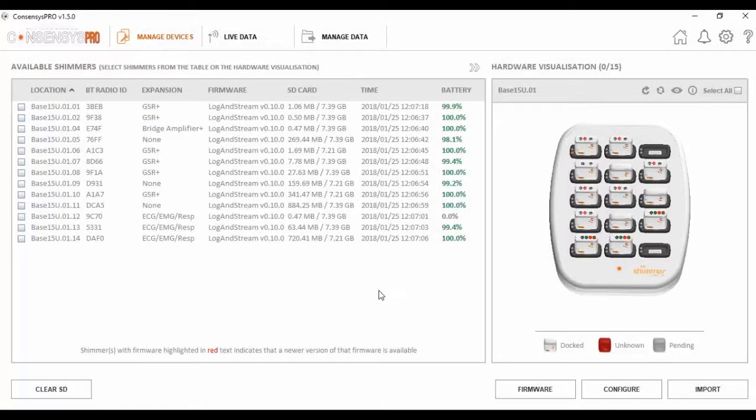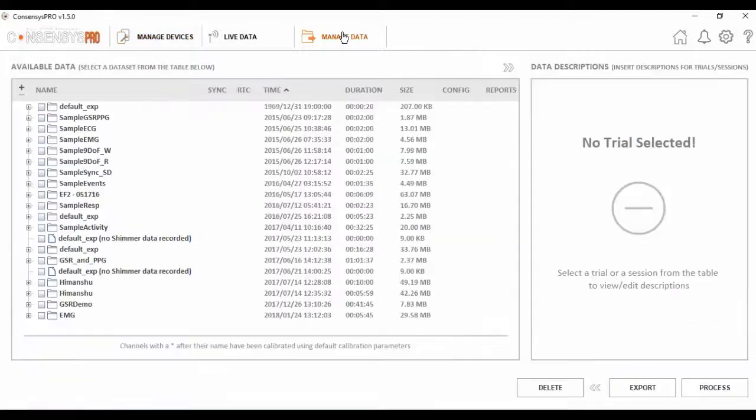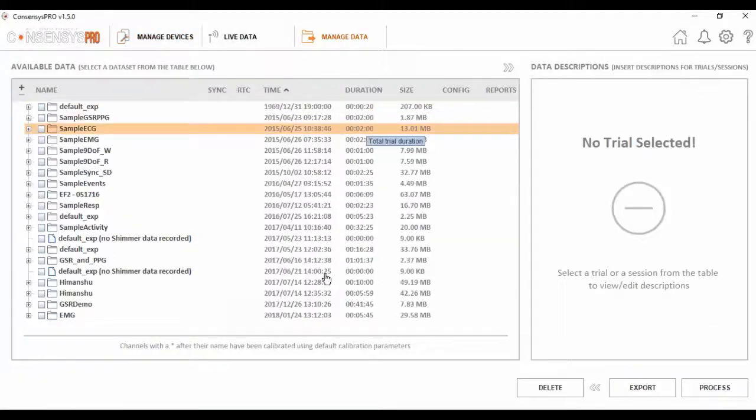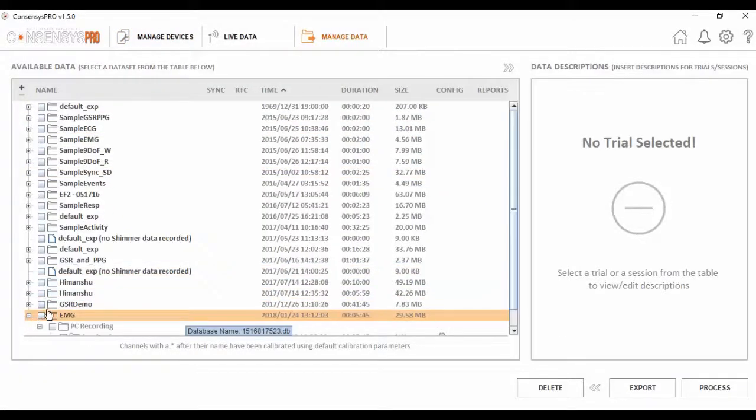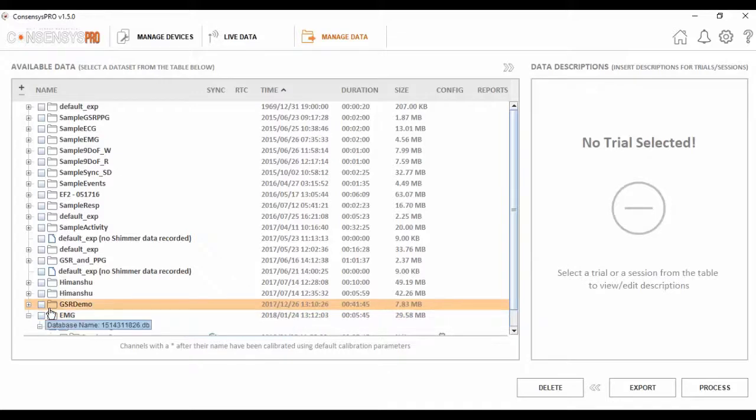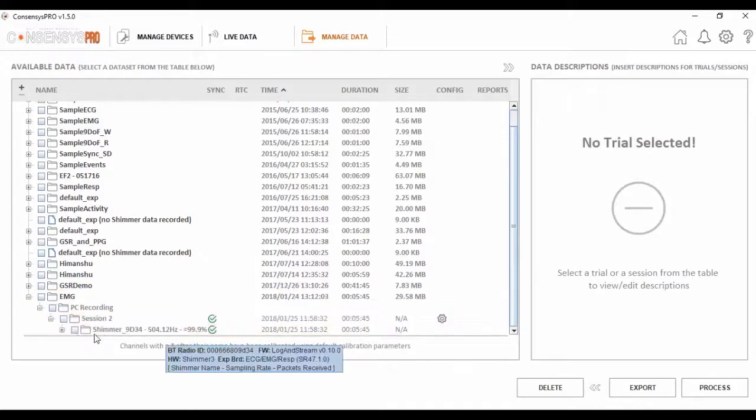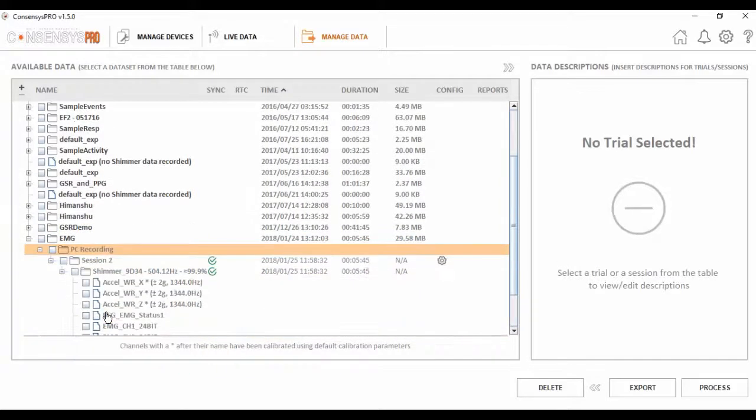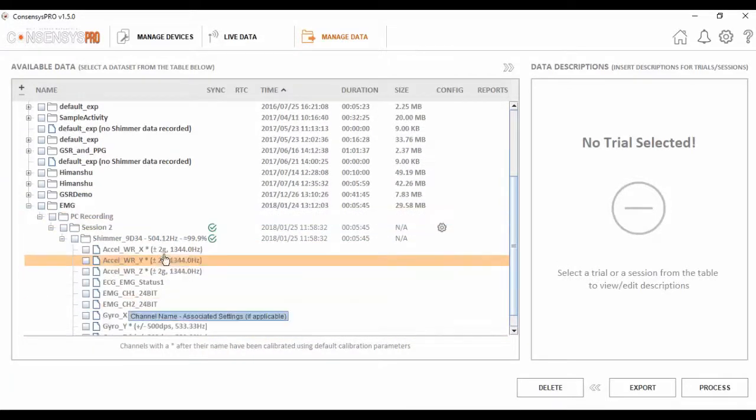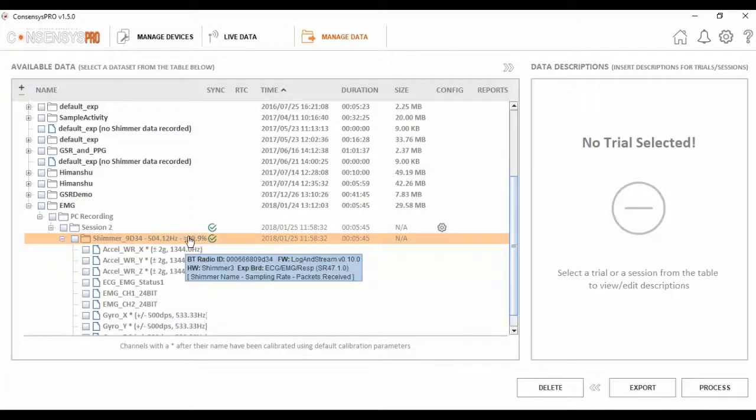So I've now completed collecting data for this demo. The next step is to retrieve the data. Firstly, the live stream data is automatically saved onto the local database. I can see this in Manage Data under the trial name I set earlier, EMG. We can see here the transmission rate was very high, with little to no dropped packets.